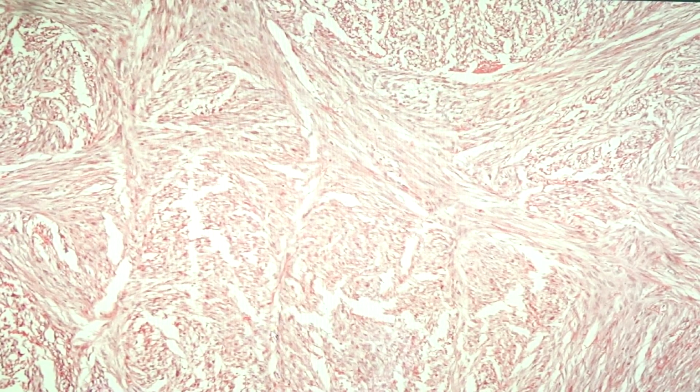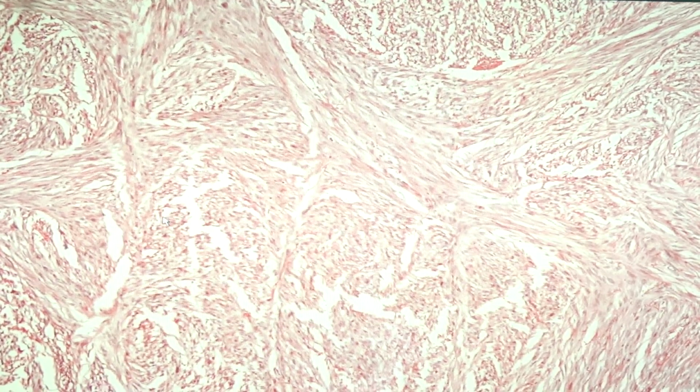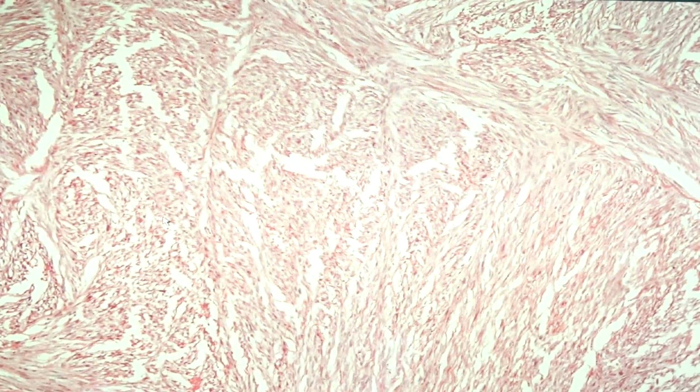So there's a line here, and then it would radiate to one side, radiate to one side, radiate to one side. That is the herringbone pattern in this case. It's like having a line and then it transects from one area to another. So this is fibrosarcoma.